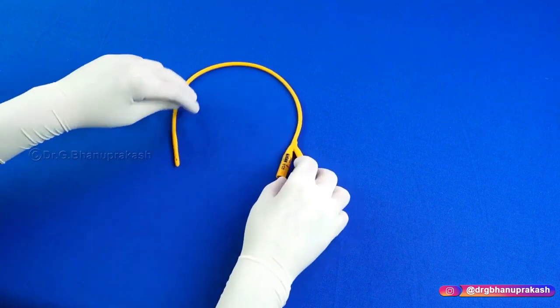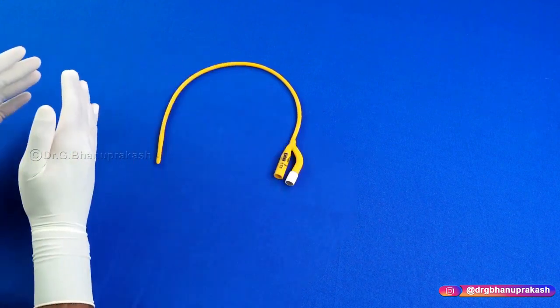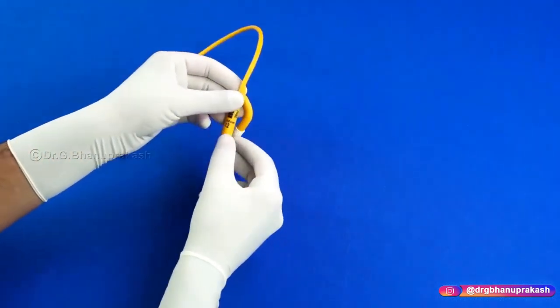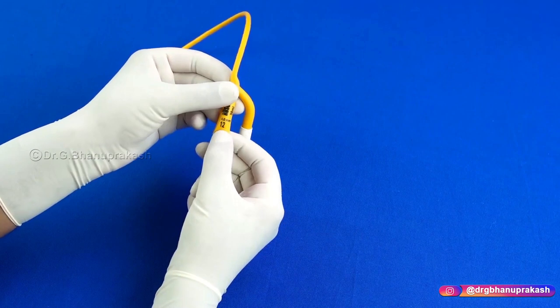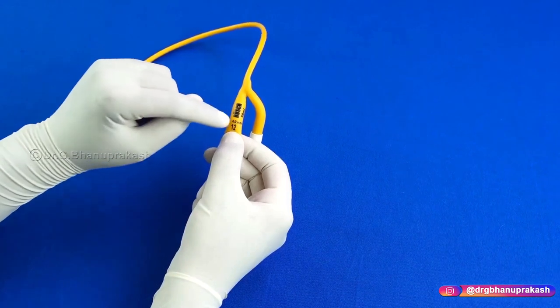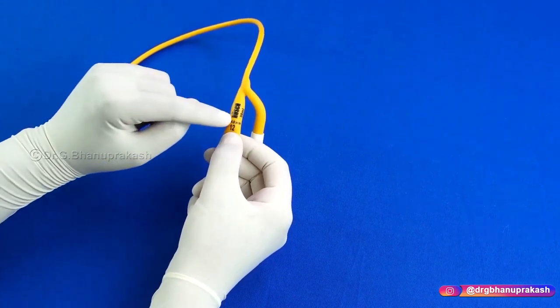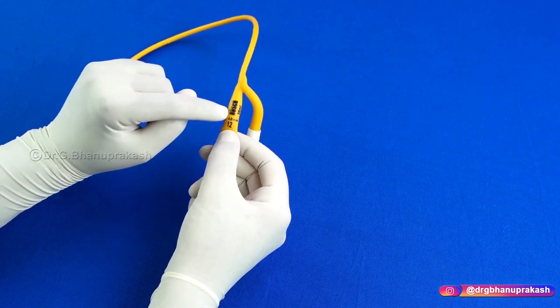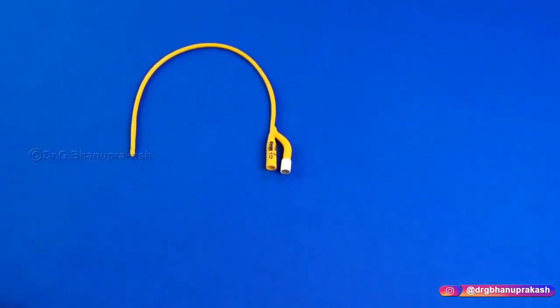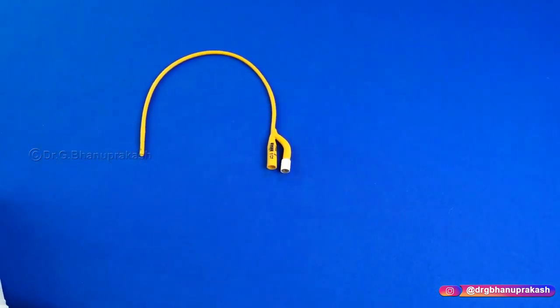But before that, one very important thing you need to know is that there are different sizes of a Foley's catheter. As you can see here, this is size 12. So on the Foley's catheter there will be written FR12. Most Foley's catheters will have FR12, FR14, FR16. What does FR stand for? FR stands for French gauge or French size.